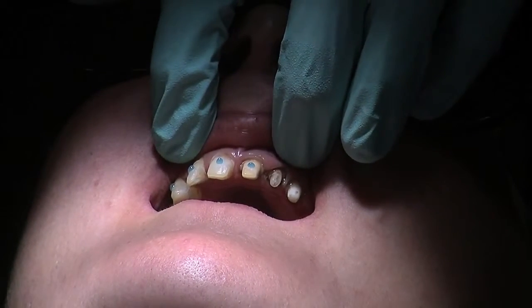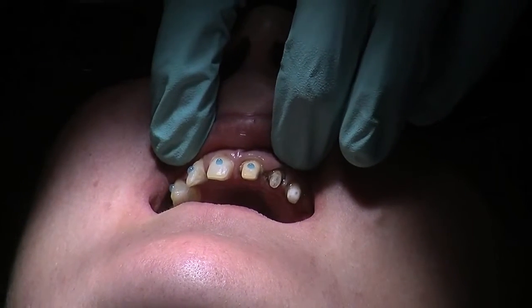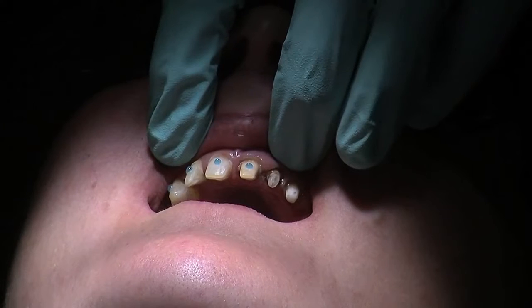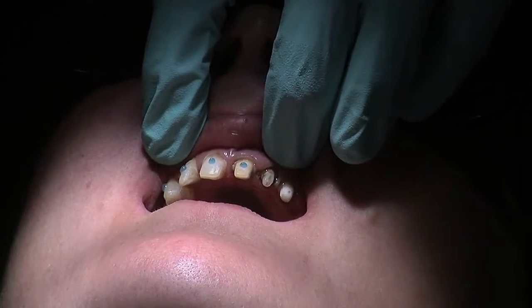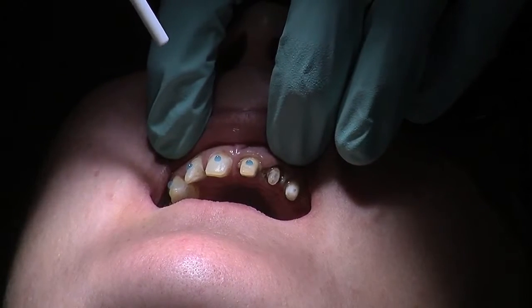I've placed a very, very thin layer of Vaseline over the composite cores because I'm using a composite material for the trial smile and I don't want it to bond to those teeth. So literally 15-20 seconds here. I'm just going to wash this off now.